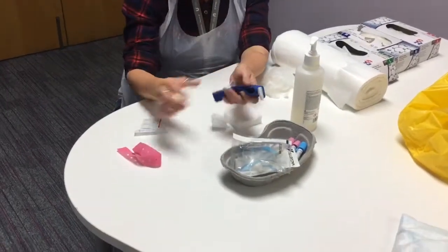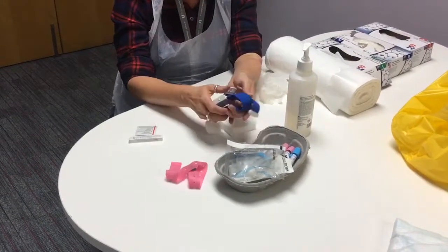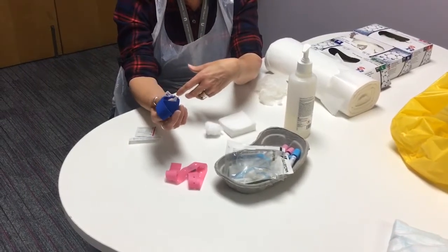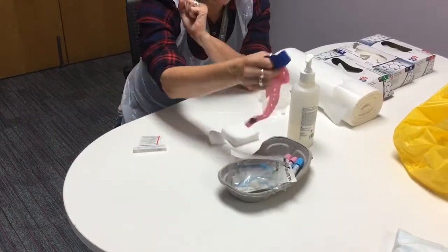You need a tourniquet, obviously. In clinical practice we use disposable ones, as you can see here, but I might demonstrate today with one of these — the principle's the same. You must have a tourniquet when you're doing these procedures; it's absolutely essential, you can't manage without it.